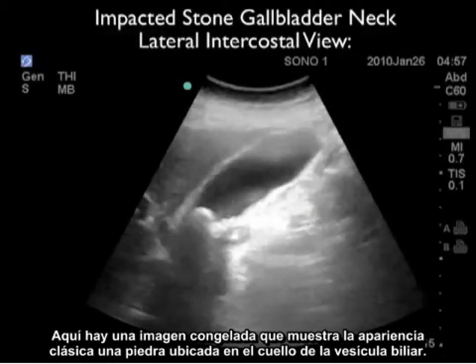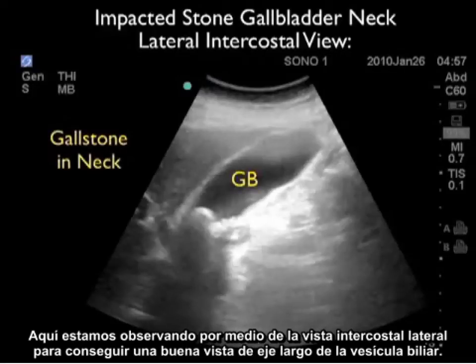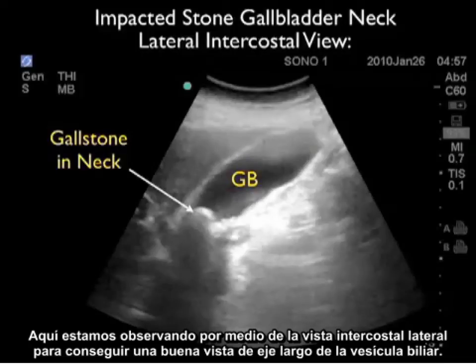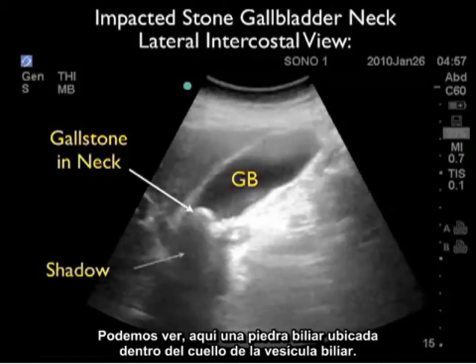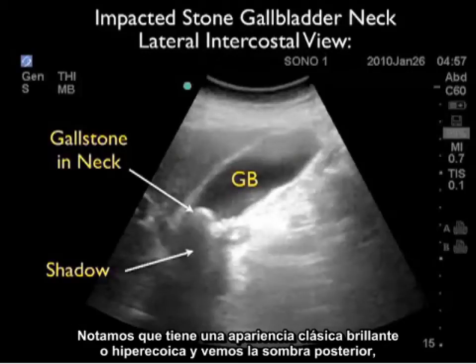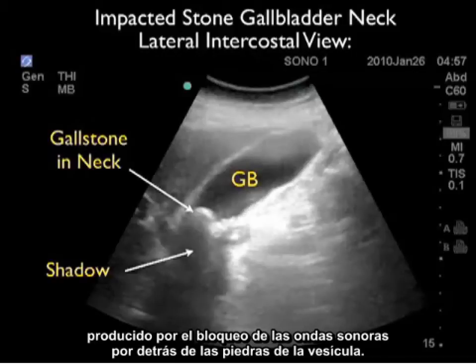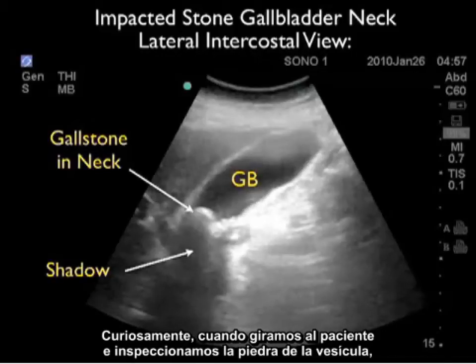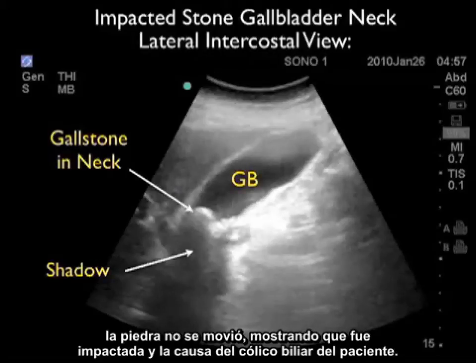Here's a still image showing the classic appearance of an impacted stone at the gallbladder neck. We're looking through the lateral intercostal view, giving a nice long axis view of the gallbladder. We can see a gallstone located within the neck — it has the classic bright or hyperechoic appearance, and we see the hard shadow, the blackout of sound waves, posterior to the gallstone. Interestingly, as we rolled the patient around and inspected the gallstone, it failed to move, showing it was impacted and the cause of the patient's biliary colic.